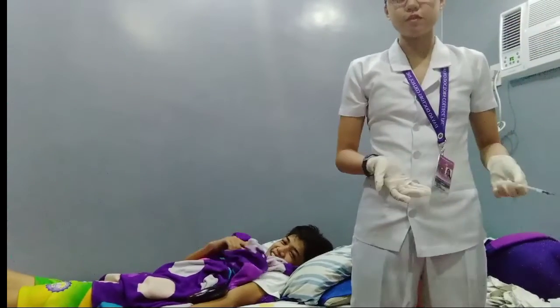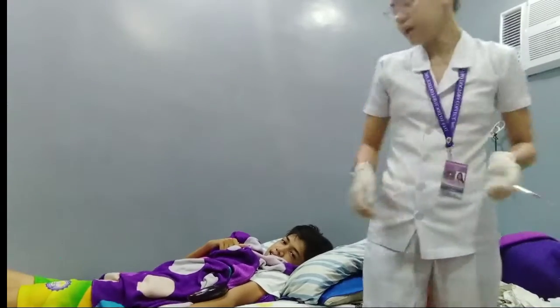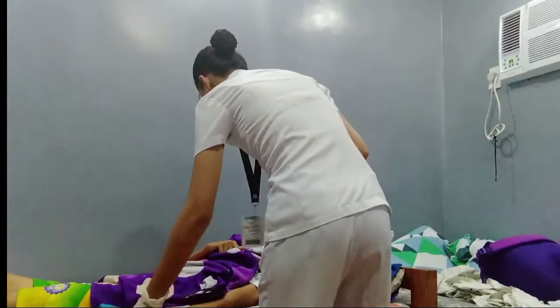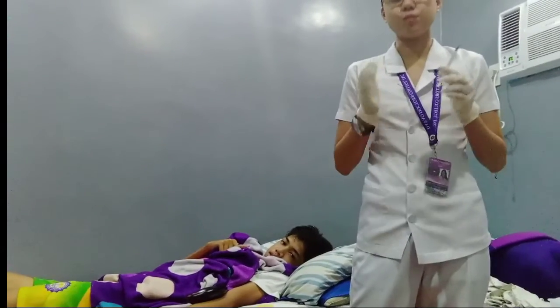Assist the patient to a more comfortable position, indicating the site and time of reading. Okay, so exactly 10 a.m. Okay, are you in a comfortable position? Yes. Okay. Don't recap the used needle; discard the needle and syringe in the appropriate receptacle.